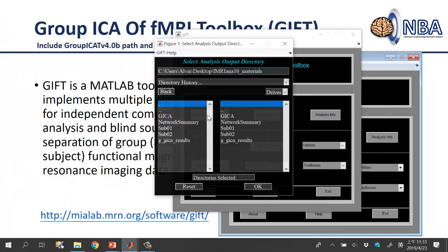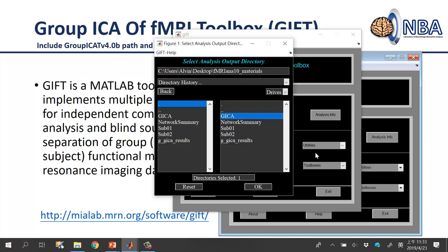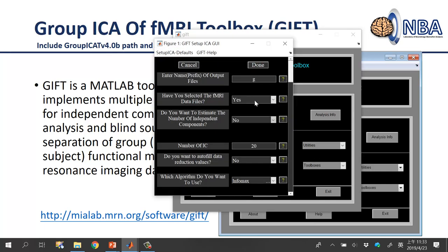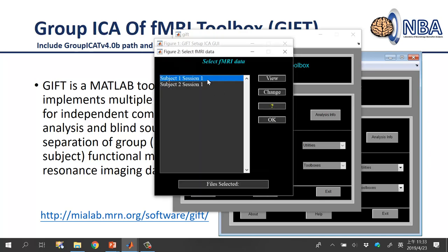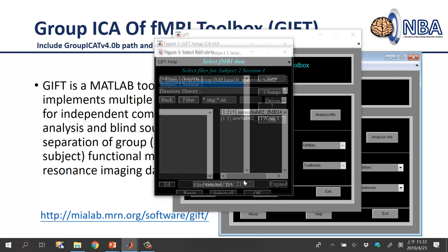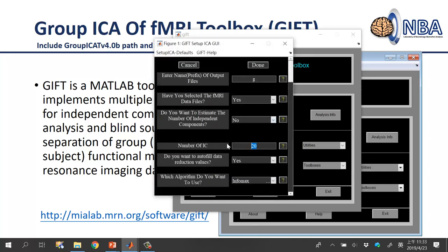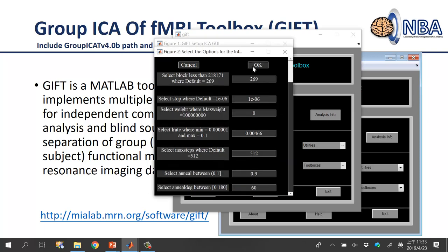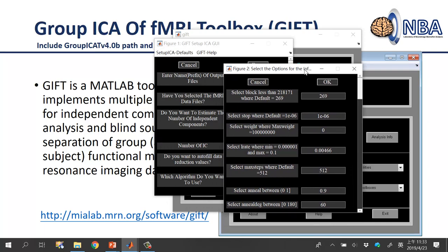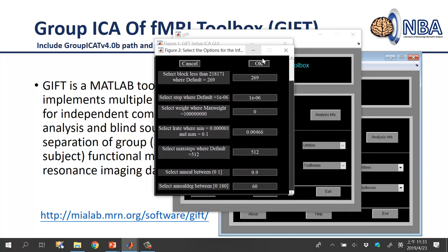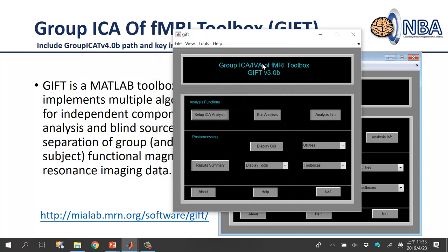Redo the setup: select the gICA output folder, enter 'G' as the prefix, select files for both subjects, enter 25 for the number of ICs, and click Done. A second parameter dialog will appear — you don't need to change anything there, just click OK. That completes the ICA analysis setup.